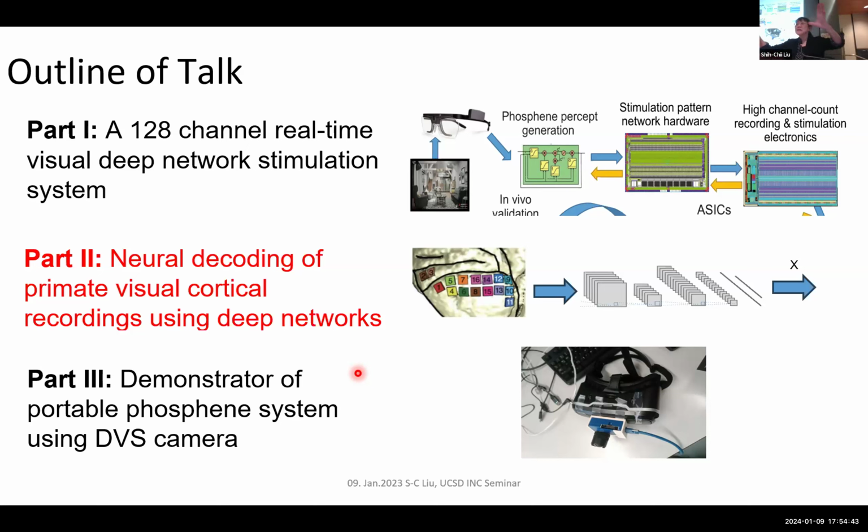Just imagine you have the whole image here, and I just show you a dot of where the phone would be. Because there's a network that's processing that image. Yeah. Exactly. Right. So you just want to give information to the person, right? Because they just see these bright dots, and where they see them depends on which electrode you stimulate. And so you could give them like a code, right? What do the dots mean also?